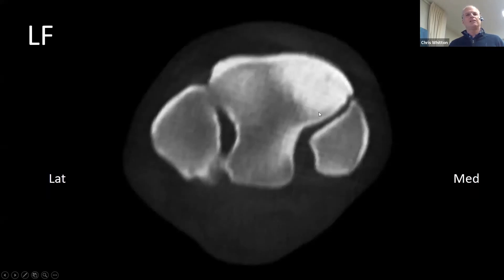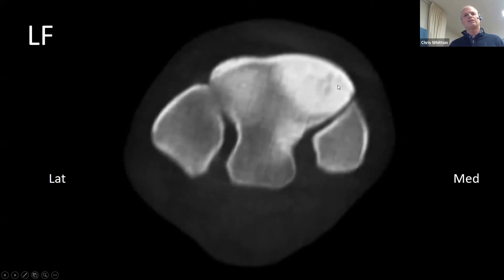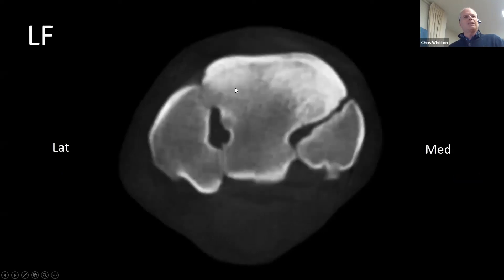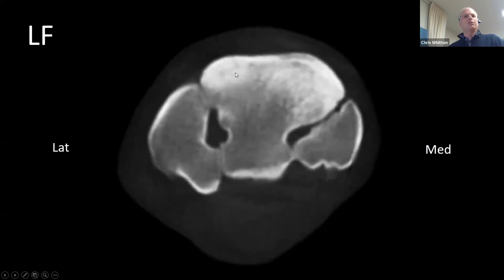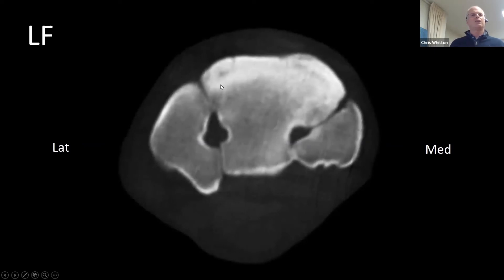We've CT'd it and here in the left fore we can see we've got a lot of sclerosis in the radial facet, and then near the articular surface of the mid-carpal joint we've got these areas — which we can very easily delineate on CT — of focal resorption. We couldn't see these other ones on the intermediate facet until we went down into the carpometacarpal joint distally on the third carpal bone, where you can see sclerosis and focal lysis in the subchondral bone very close to the carpometacarpal joint.